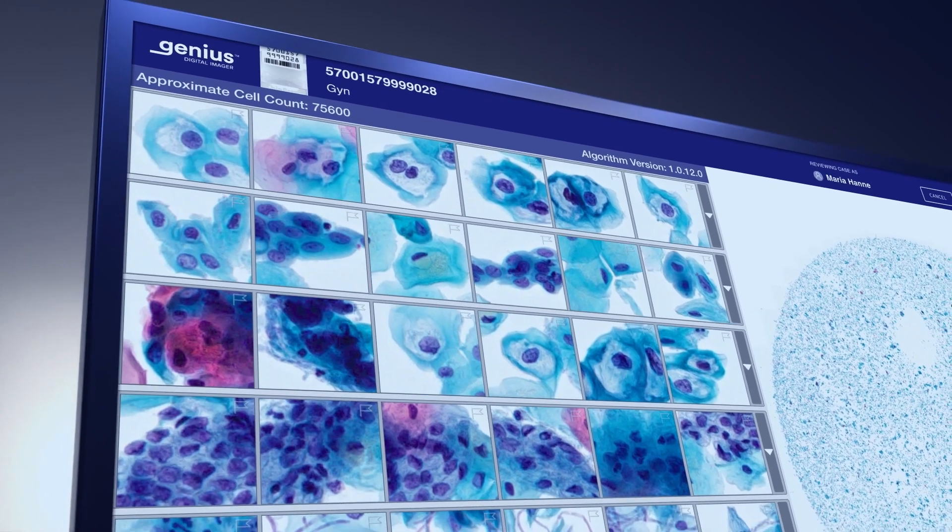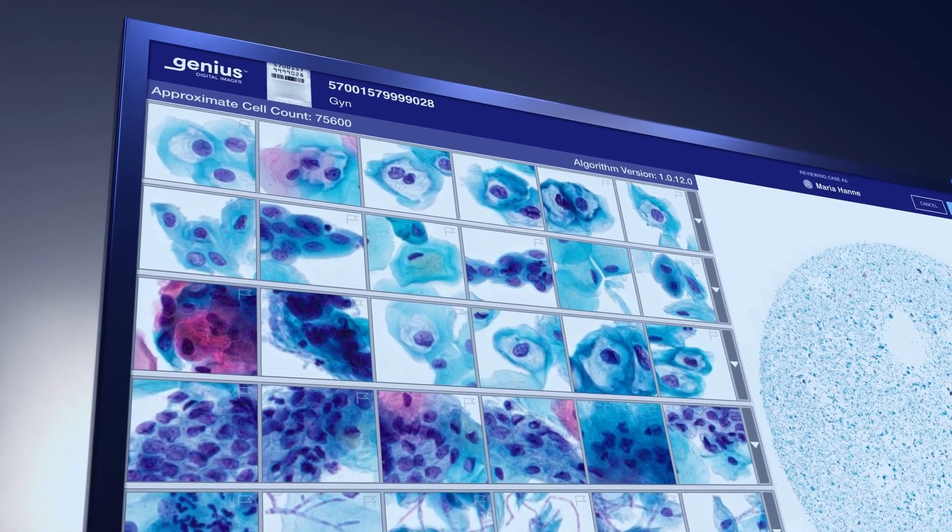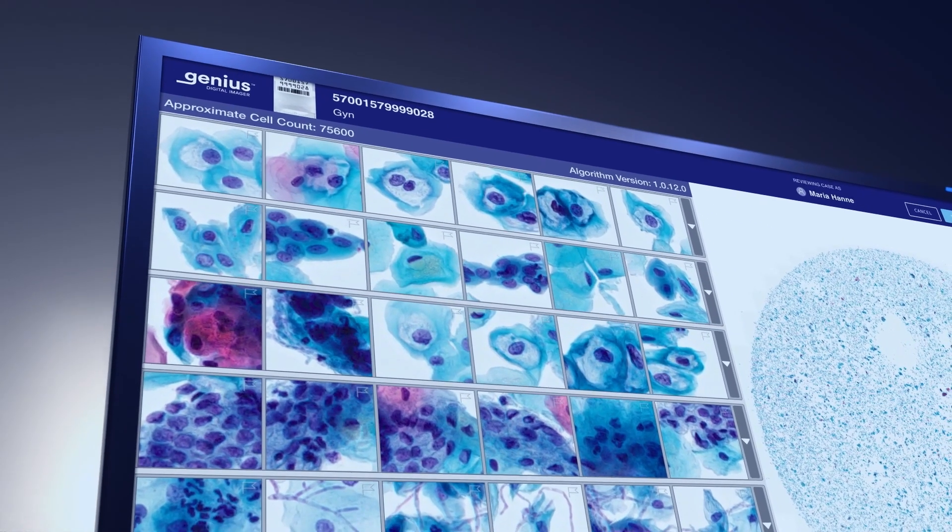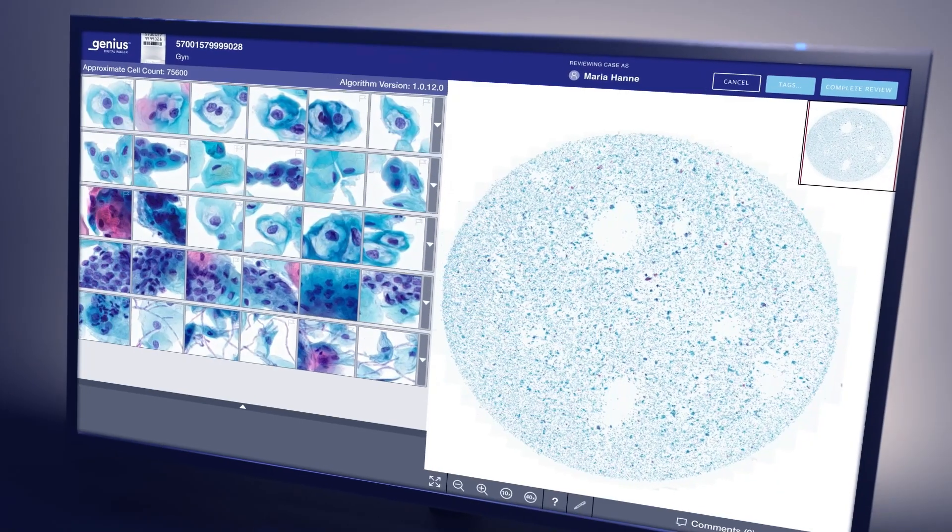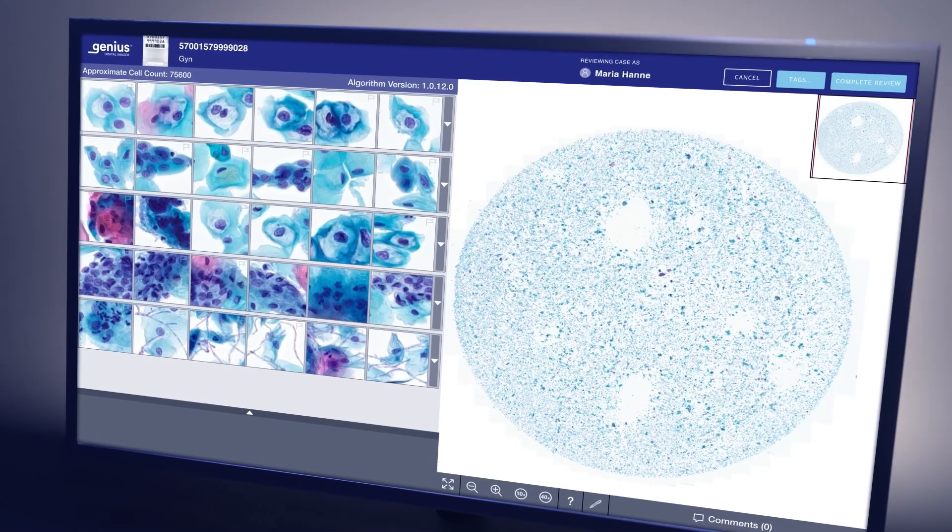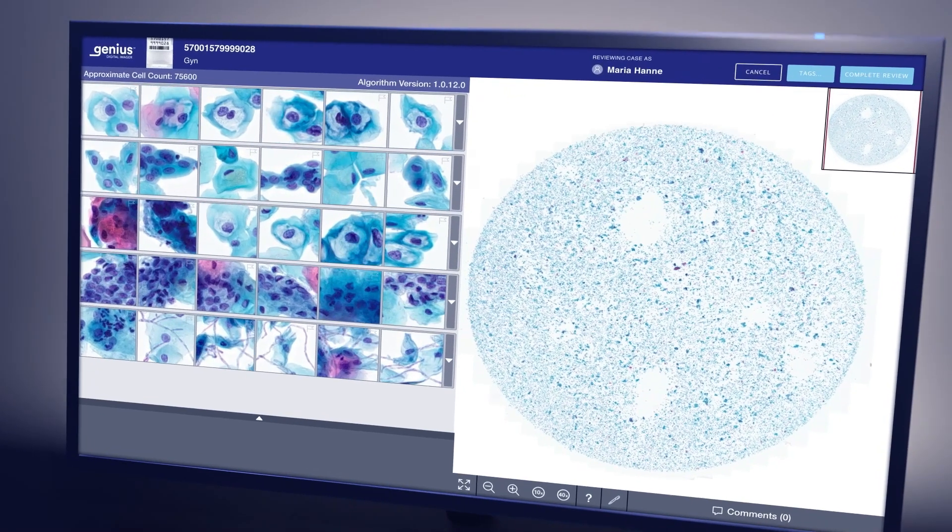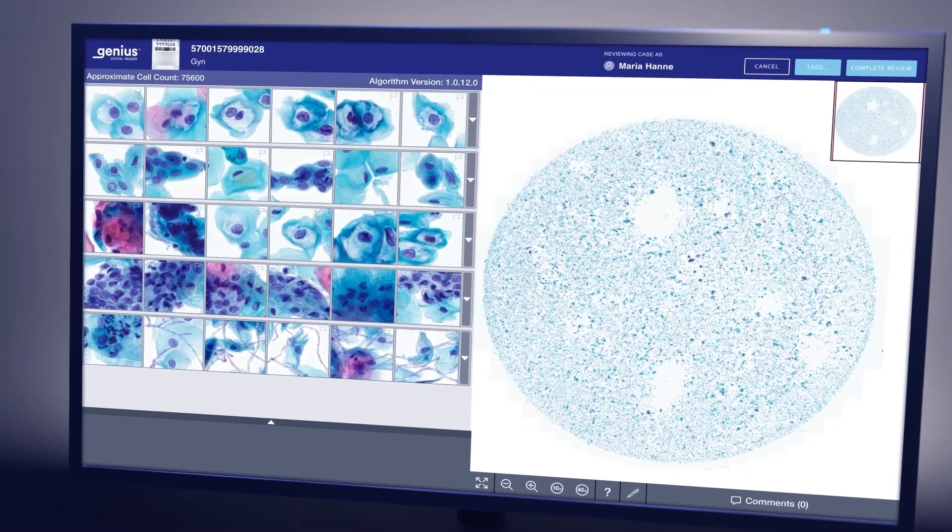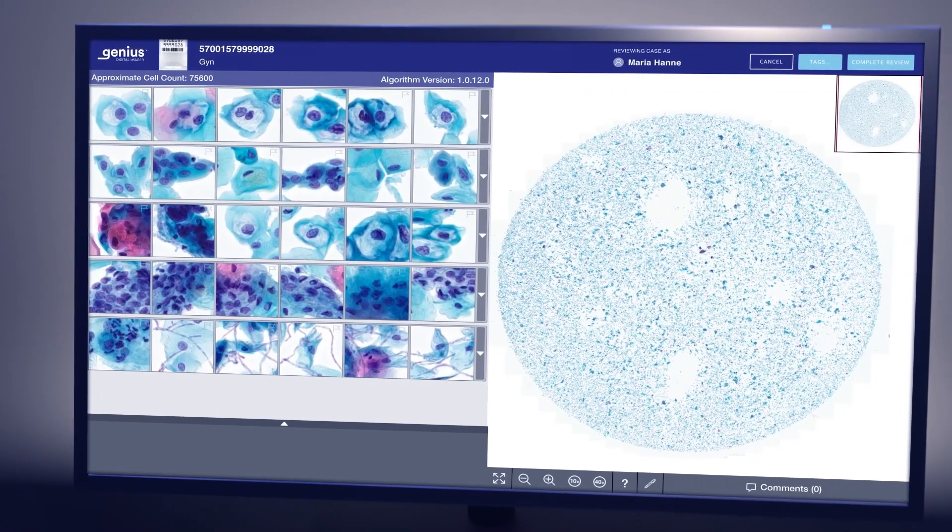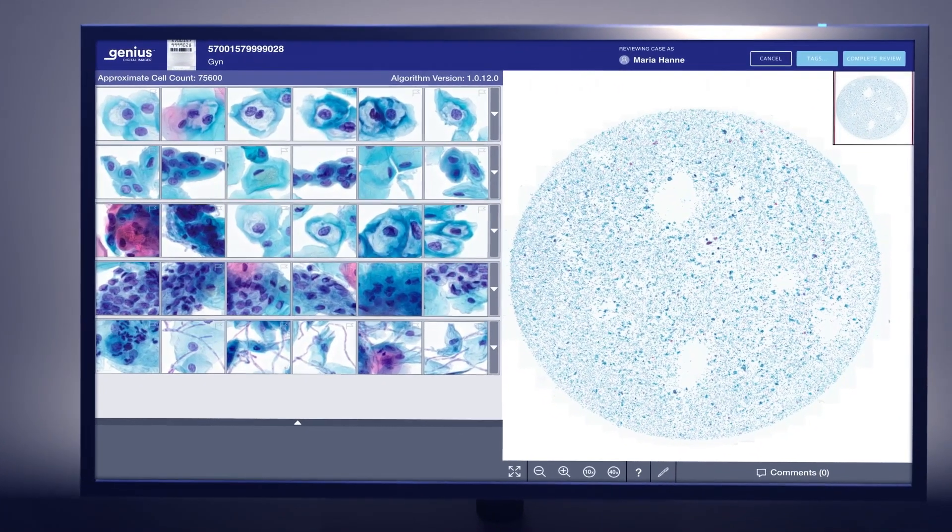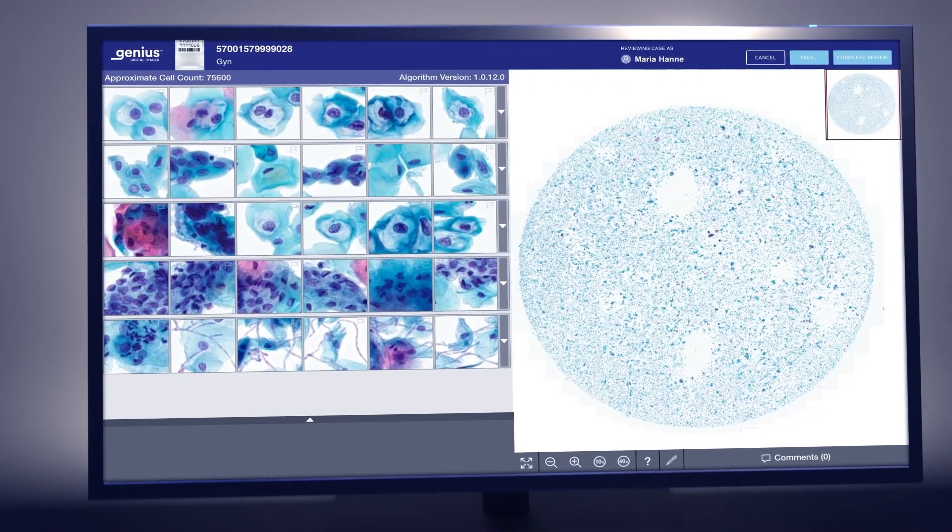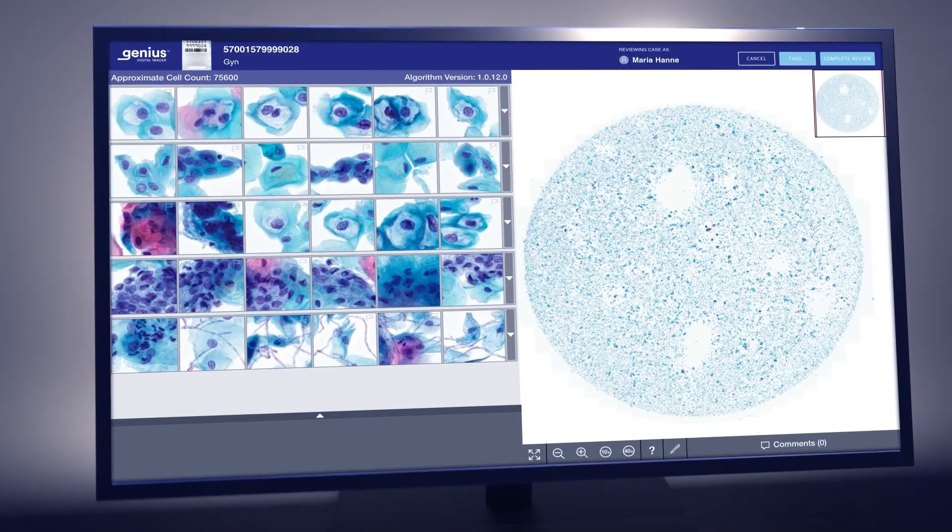To further streamline review, the algorithm provides an estimated cell count to assist and standardize adequacy determination and identifies glandular cells and infectious organisms.